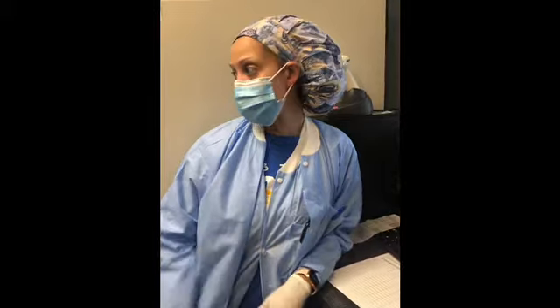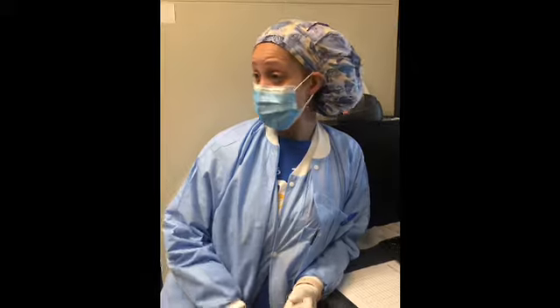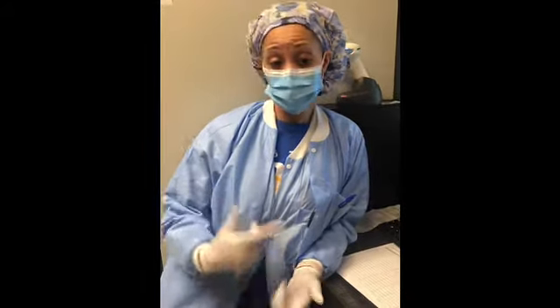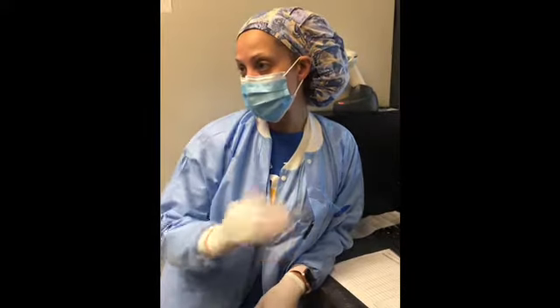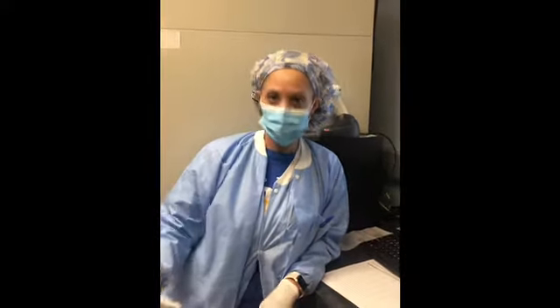If the patient was not transfused, then if you wanna do it in a tube, I would prefer to do it in a tube and not repeat it in a gel, because you're gonna get the same results in the gel from here in manual gel. If you have mixed field in the tube, then in that case, you would call the nurse and say, hey, was this patient transfused somewhere else recently? Patient could have been transfused somewhere else recently. And if that is the case, get the hospital and get the dates if possible. Call that hospital, see the last transfusion date of the patient. If the patient was transfused with out of type units, that's still your justification that this patient is this due to being transfused at Grady Hospital on this day, received O-neg units. Yes.